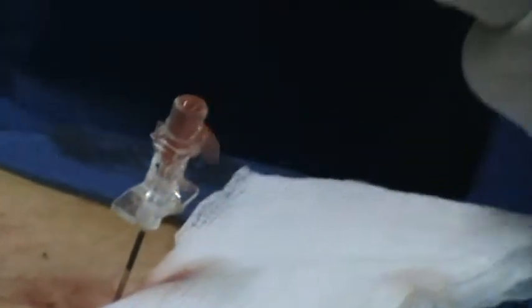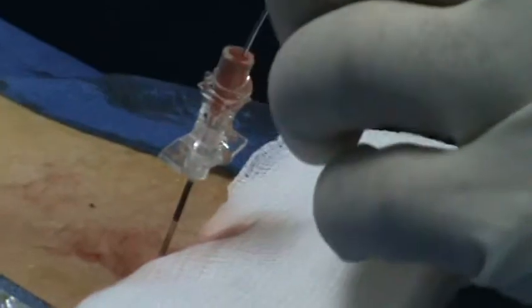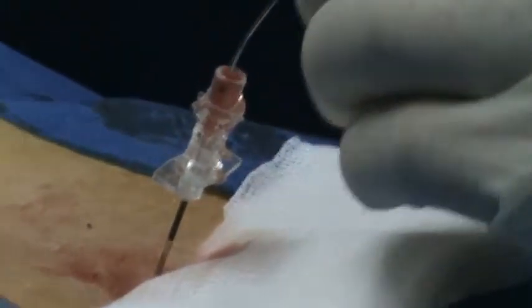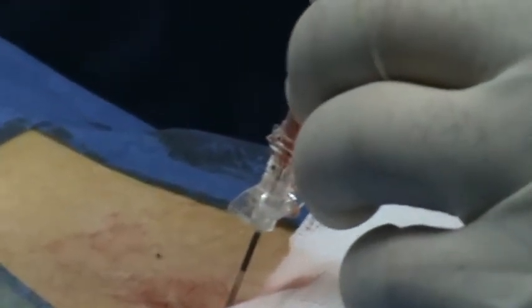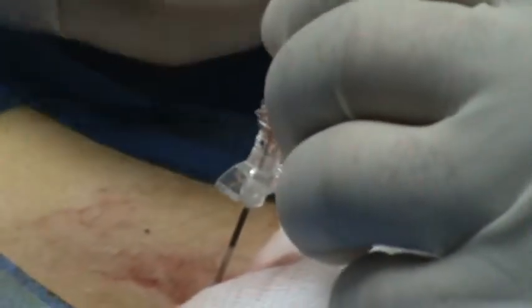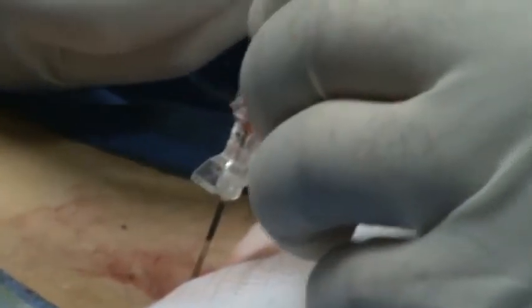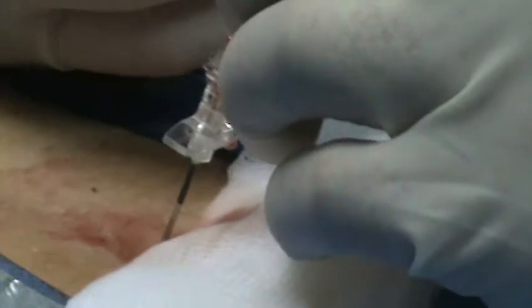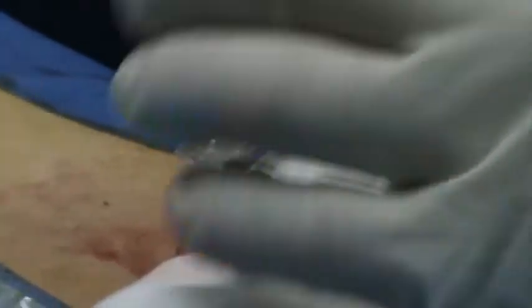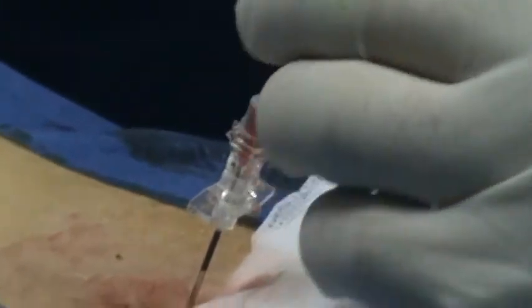And the doctor is preparing to insert a thin sterile catheter into the canal, and this is threaded up into the upper thoracic spine.